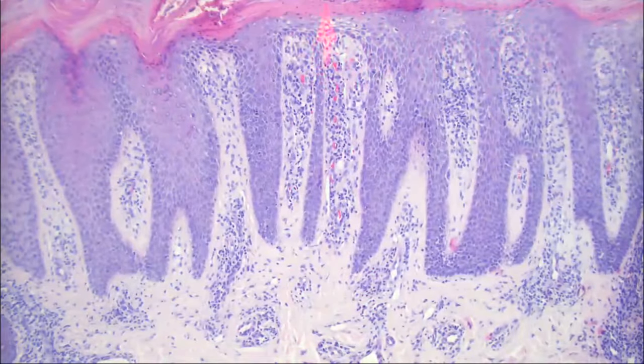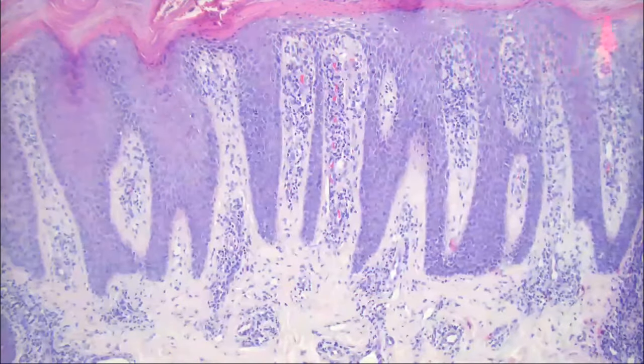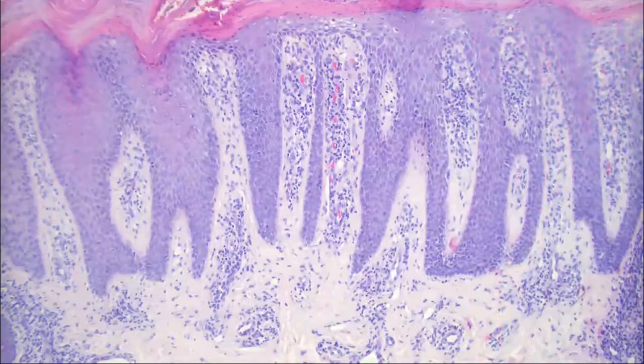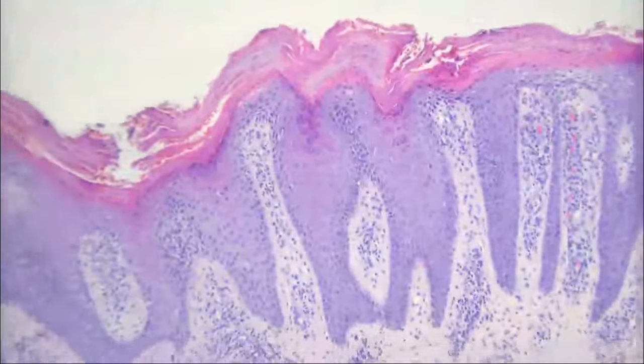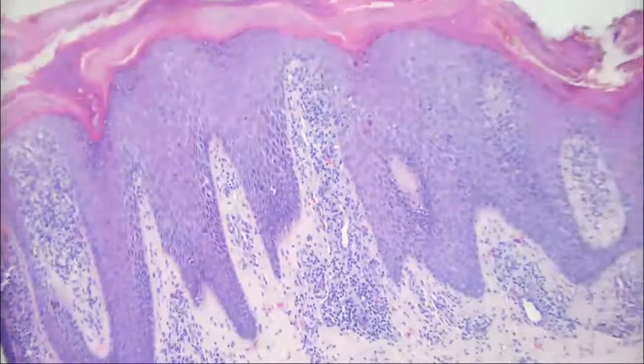What else is up here besides just neutrophils? Yeah. What about the cornified layer? What about the granular cell layer? I don't really see anything. It's absent, basically. Maybe focally present. Ah, there's our superstar just showed up.